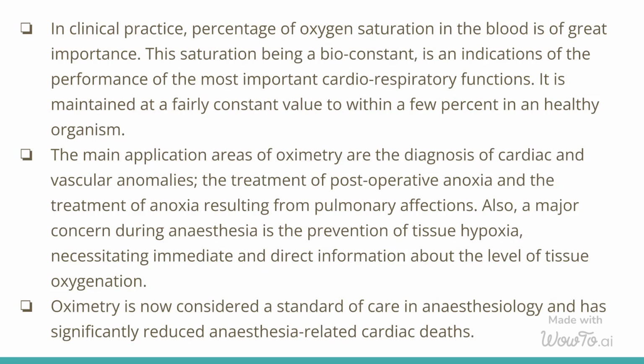Oximetry applications refer to the various uses and benefits of measuring oxygen levels in the blood using an oximeter device. Oximetry is commonly used in healthcare settings to monitor and assess the oxygen saturation levels of patients, particularly those with respiratory or cardiovascular conditions. It is also utilized during surgeries and intensive care to ensure adequate oxygenation.